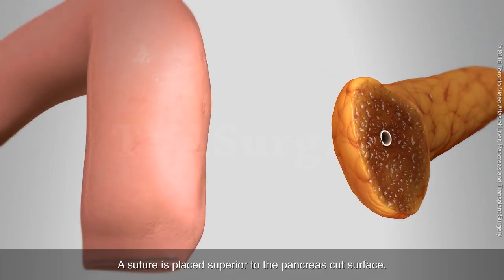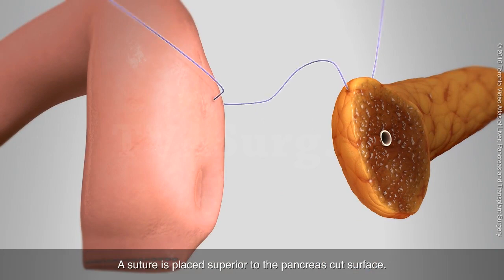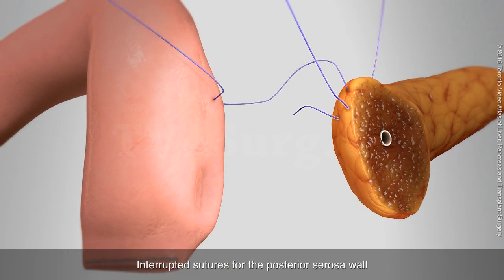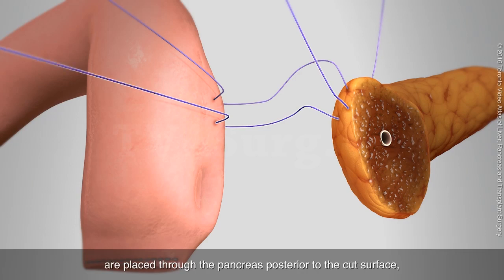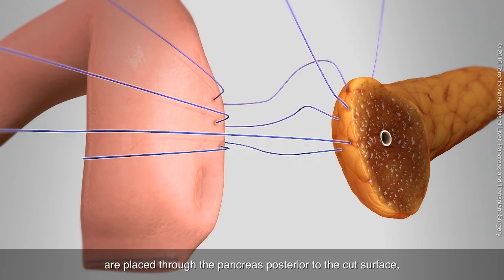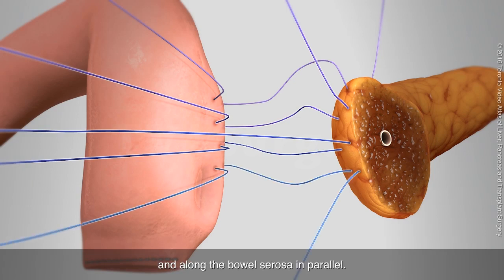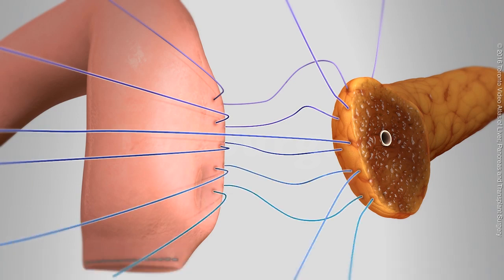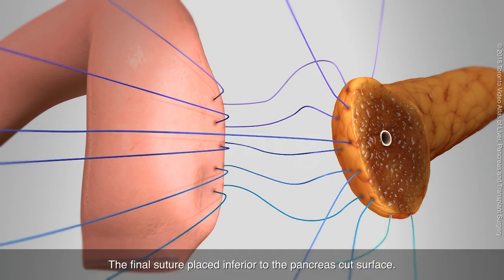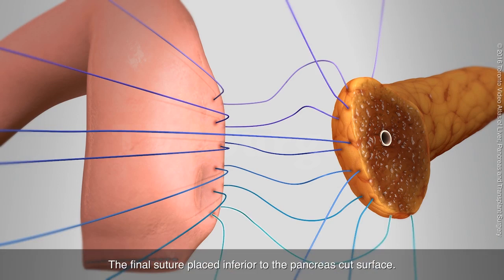A suture is placed superior to the pancreas cut surface. Interrupted sutures for the posterior serosa wall are placed through the pancreas posterior to the cut surface, and along the bowel serosa in parallel. The final suture is placed inferior to the pancreas cut surface.